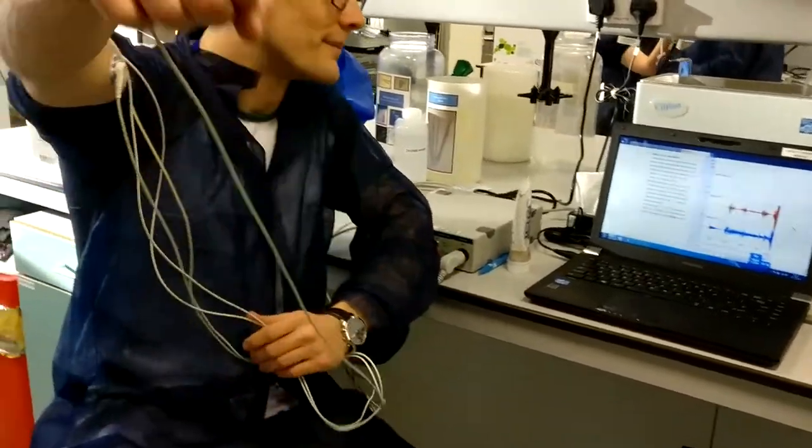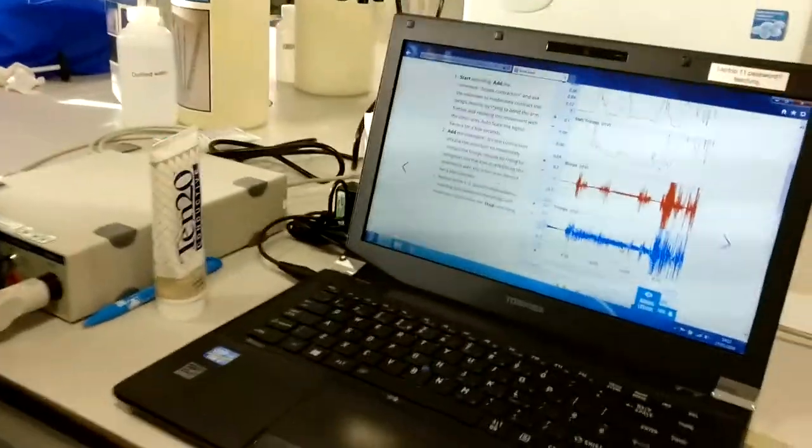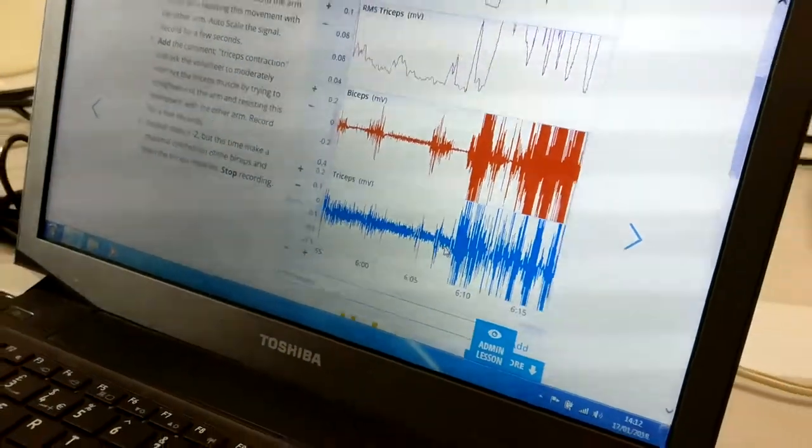Basically whenever Tom tenses his biceps or does something with his arm, you can see a corresponding jump on the biceps and triceps meter.